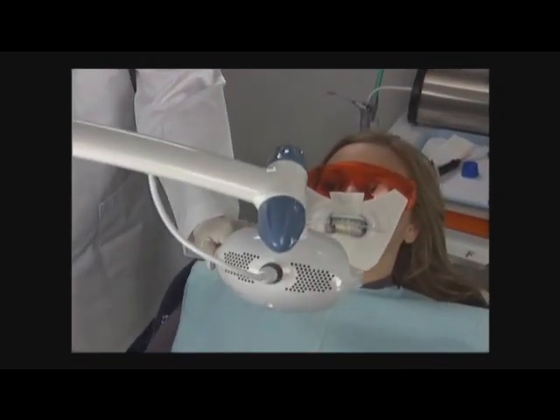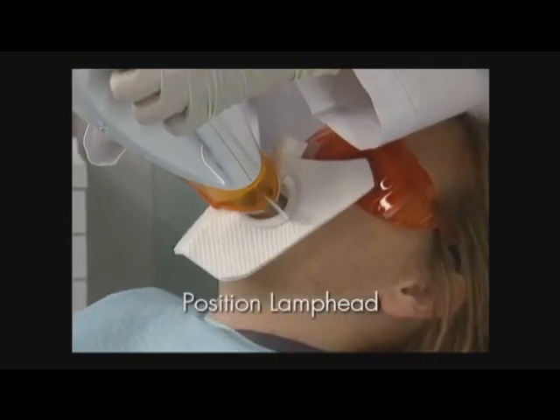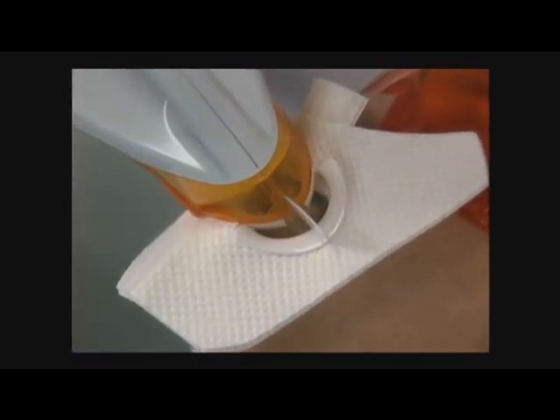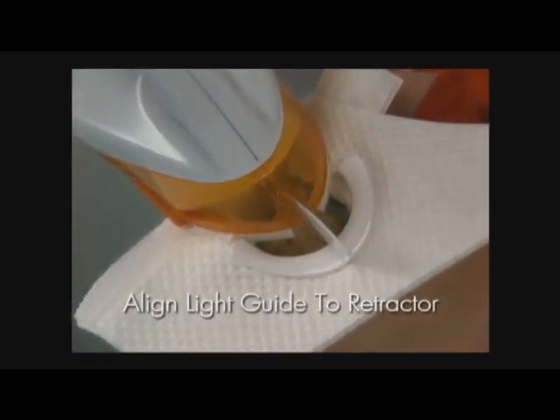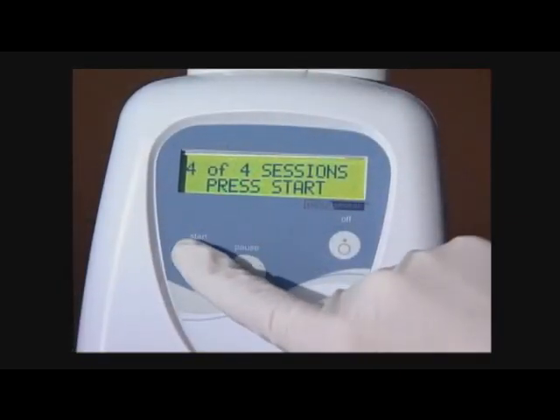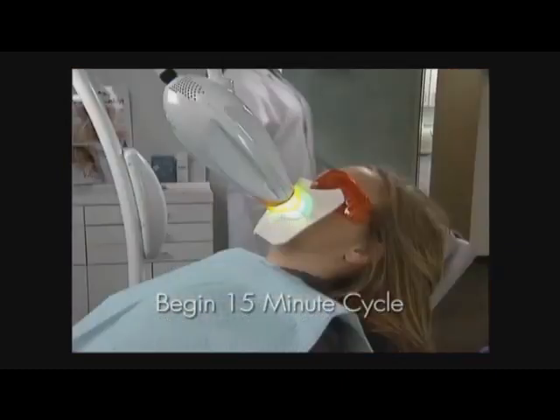Slide the lamp into place next to the patient. Position the lamp head to the patient's smile zone, aligning the slots on the light guide with the retractor. Place the end of the retractor into the slots located on either side of the light guide. Press the Start button on the display panel to turn on the light and activate the timer. It will begin the 15-minute countdown.